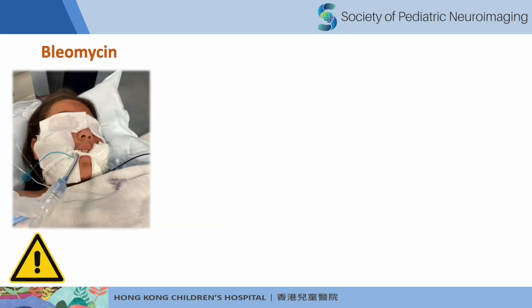So we avoid any adhesive. We use wet gauze to cover the eye, and we use a gauze roll to tape the ET tube instead of the usual tape, so that we don't leave any adhesive markings on the face.